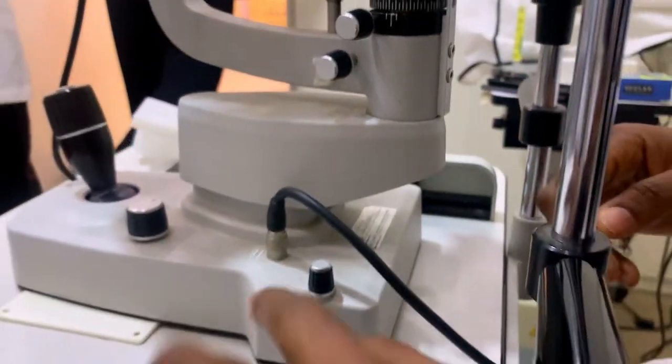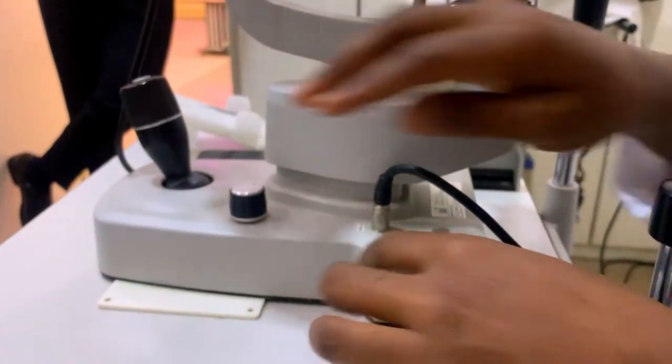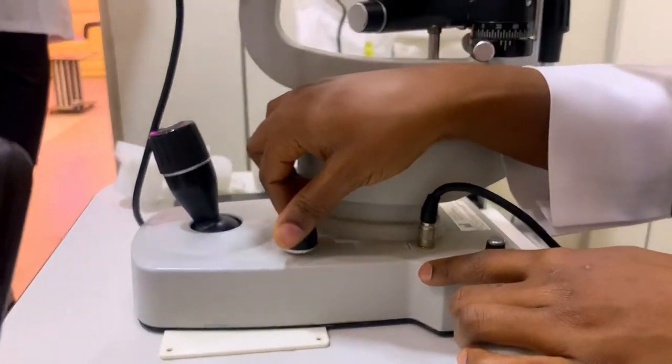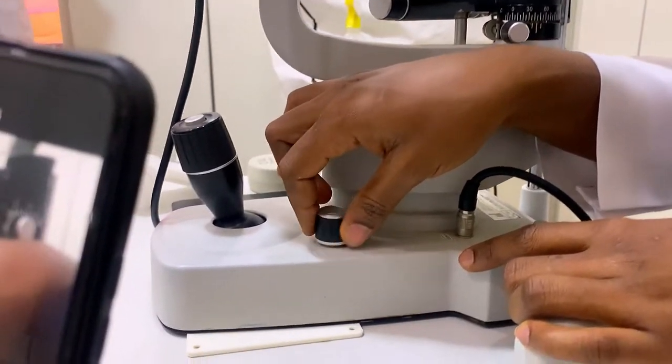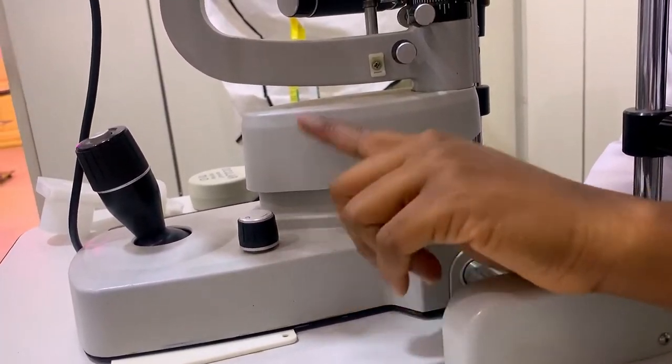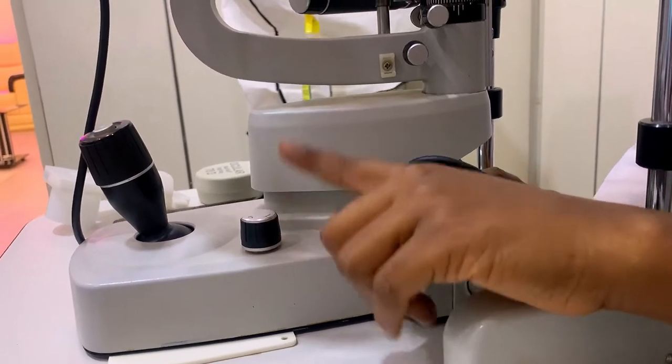After the rail and cover, the next thing is the rheostat. This rheostat is what helps you to increase or decrease the intensity of the light. Remember, it must be at the lowest before you put on your slit lamp biomicroscope.